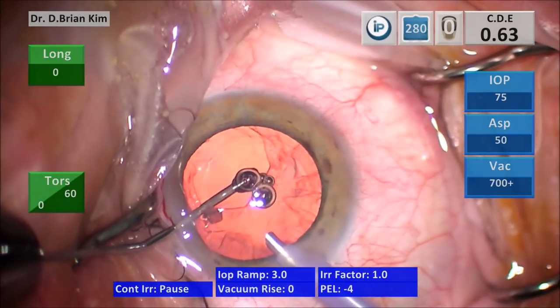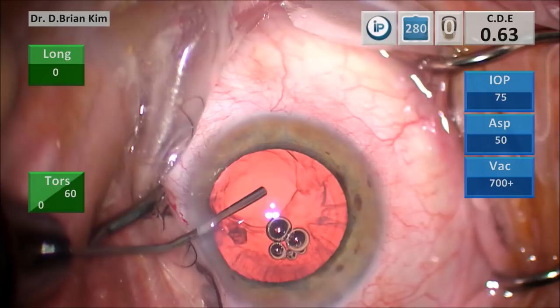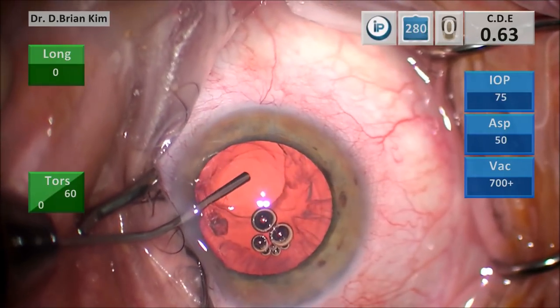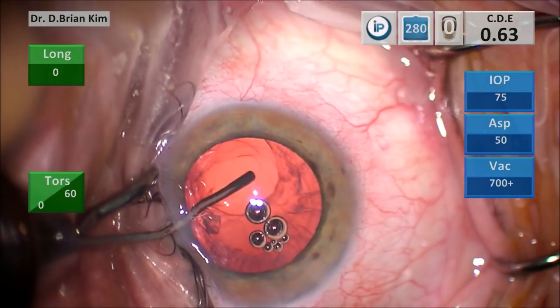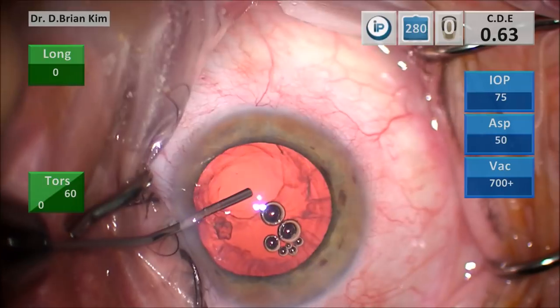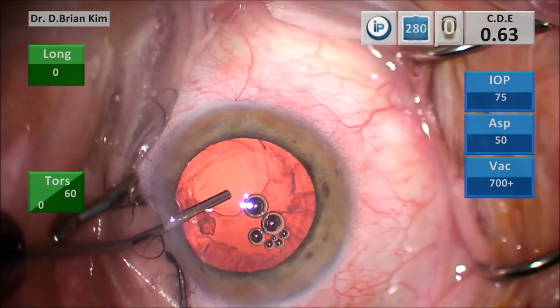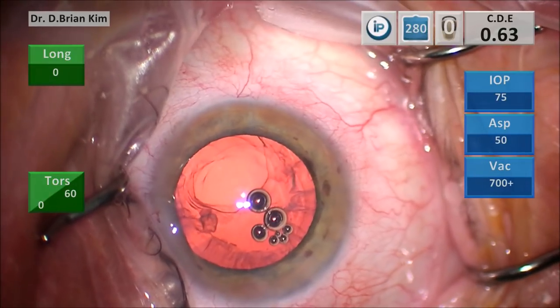I'm going to put a dispersive viscoelastic into the anterior chamber gently, and as I do that, I remove the phaco tip, and now I'm gently putting the dispersive viscoelastic into the whole area, and you want to be careful not to expand the hole while you're doing so.